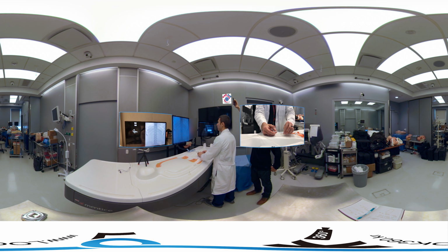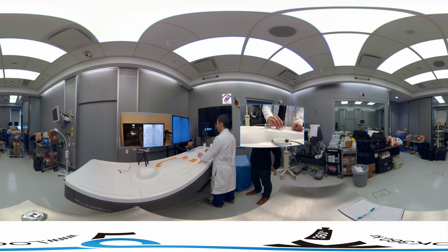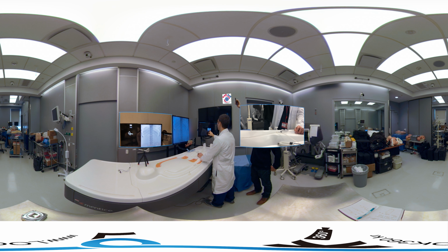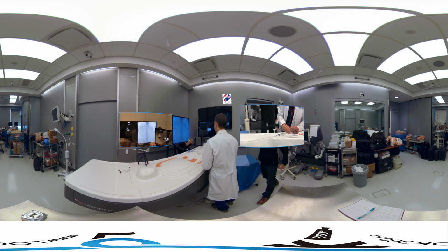The filter comes out. You can see it on the screen. It's in a good location. We'll remove the inner stabilizing wire, and we'll do one last injection just to confirm that we're in a good location. So a quick puff. Looks pretty good. And an injection. And you can see we placed the filter apex right at the level of the renal veins. Perfect for retrieval.